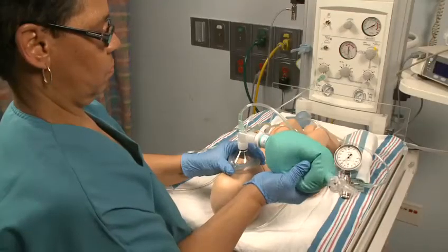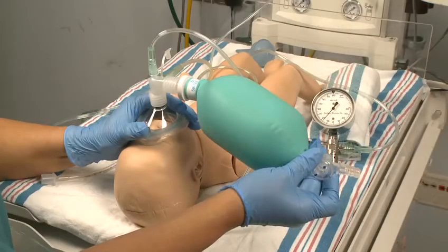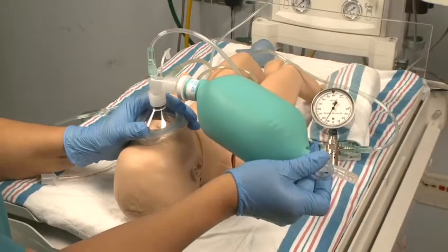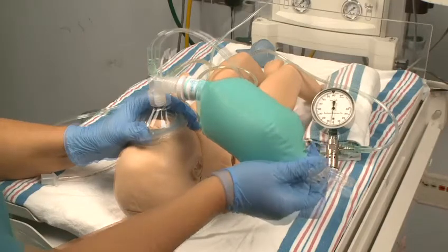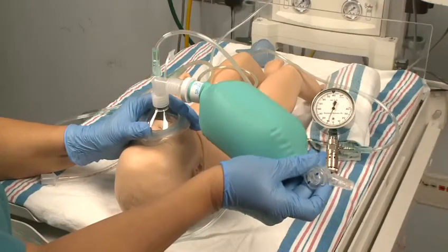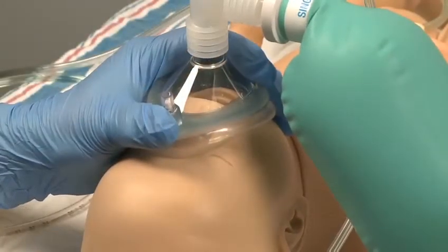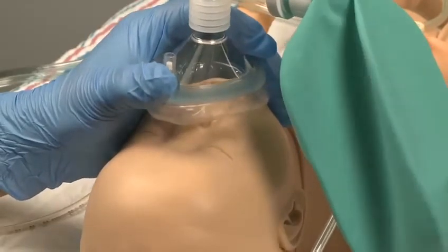The bag needs to be approximately half inflated during ventilation. If the bag is too inflated, decrease the gas flow or open the flow control valve. If the bag is not inflated enough, increase the gas flow or tighten the flow control valve. This bag can also be used to administer CPAP and free flow oxygen.